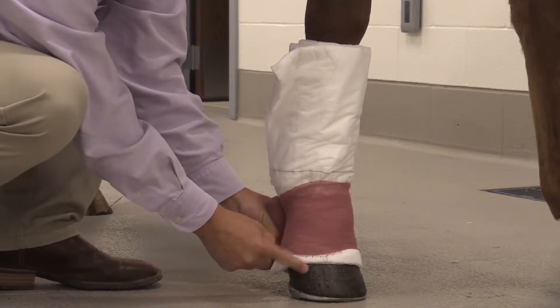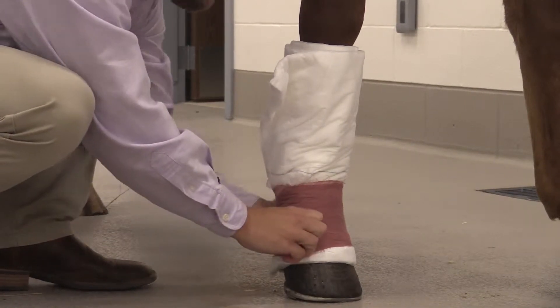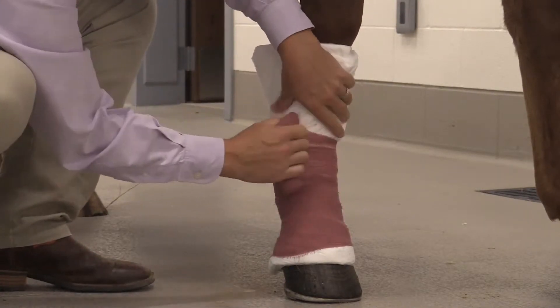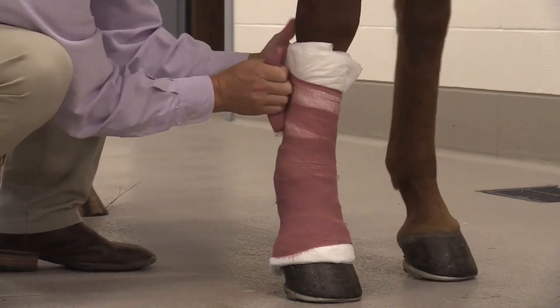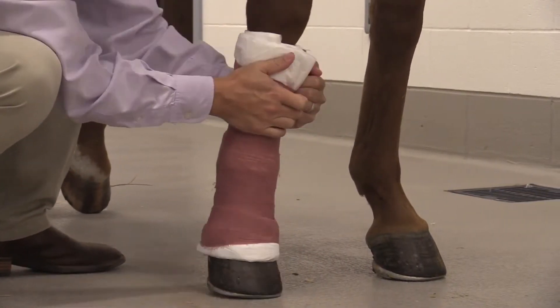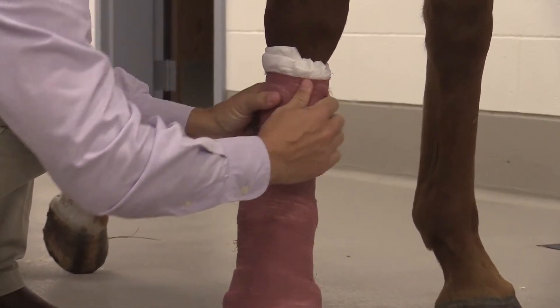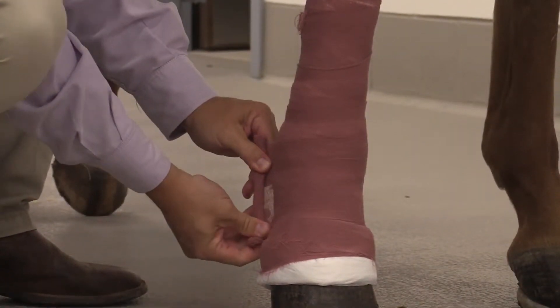We also want a little bit of the white cotton showing at the bottom and at the top, so that the only thing touching the skin is the leg cotton combi roll. As we move with the brown gauze material up the leg, overlapping by half each time, you can see how we're trying to pull this as tight as we can and avoid an accordion effect — so equal pressure with the palm of our hands, sometimes using both hands to go around the leg. You want the horse to stand as you're placing this and not to relax the leg, so it maintains the normal contour as you apply pressure with the bandage. We leave a little bit of the white combi roll or cotton roll at the top against the skin and use all of this material for the bandaging.